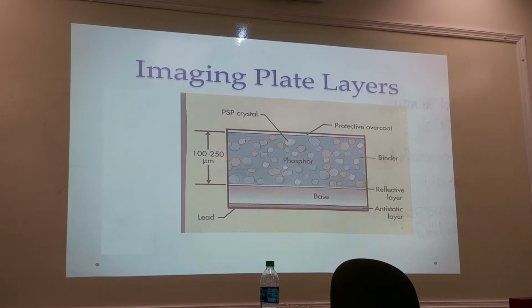These have lead in them. See? Right there, that's the lead on the back of this screen. It absorbs the backscatter? Mm-hmm. Yeah, it's just a real thin piece of lead. Can x-rays go through lead? Absolutely, but backscatter is weak, and so lead is good for backscatter.